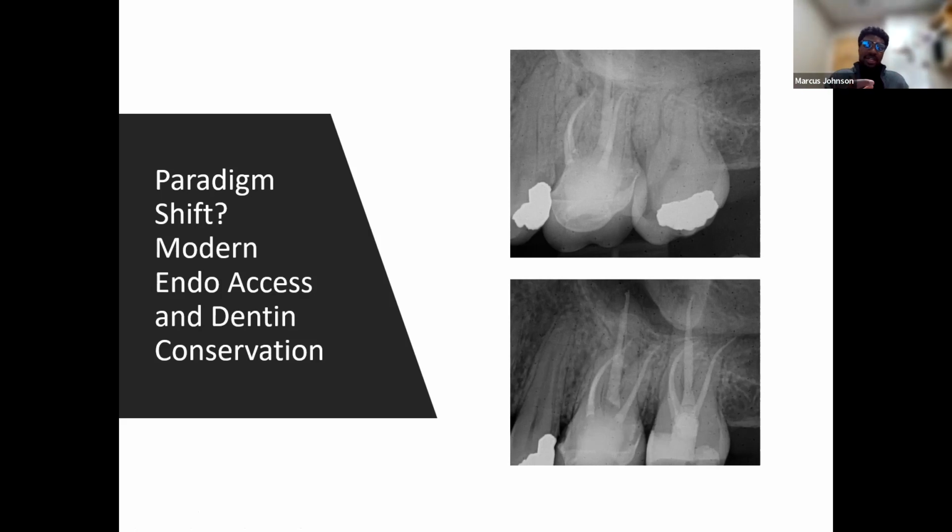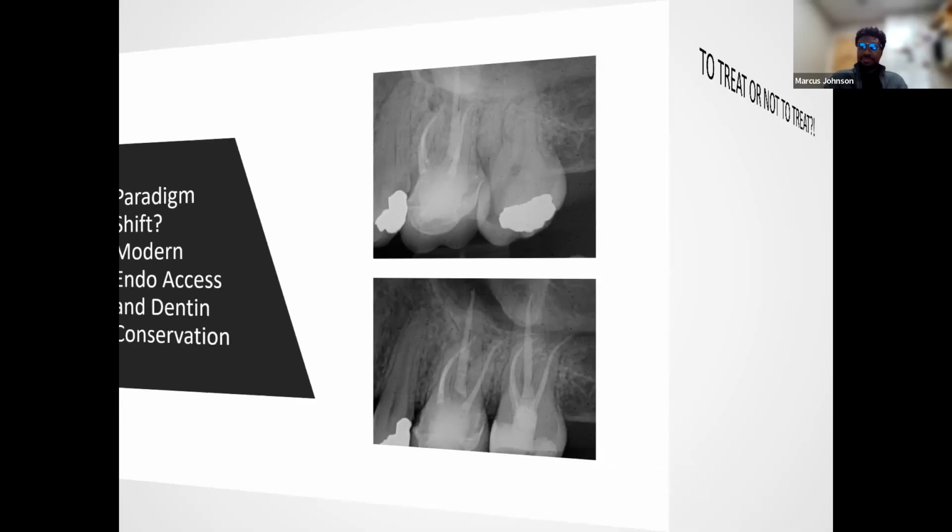But if you want the more broad contact, sometimes you have to either modify that Tofflemire, if it's a deep margin, or maybe you have to go for a sectional matrix system to actually get a more broad contact. So I stay with the Tofflemire just because of ease of access, familiarity, but you do have to have a depth of armamentarium in terms of matrices to manage a lot of these cases. And I think I'll highlight that.